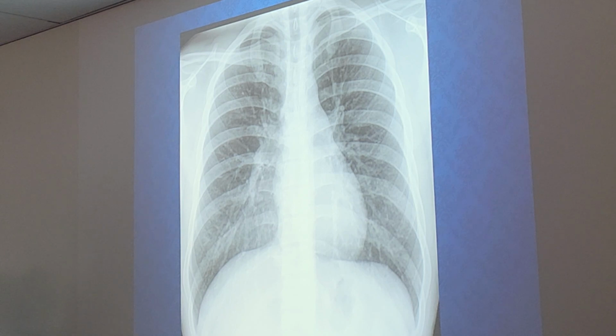Anything else we would need to know if it's AP? The right lung is always shorter than the left lung; it's going to be on the right regardless if it's AP or PA. It also depends on patient condition. Then how would the heart flip? No, the heart's not going to flip. We were just saying that on AP chest x-rays, the heart is magnified. It's always going to be pointed towards the left, regardless if it's AP or PA.